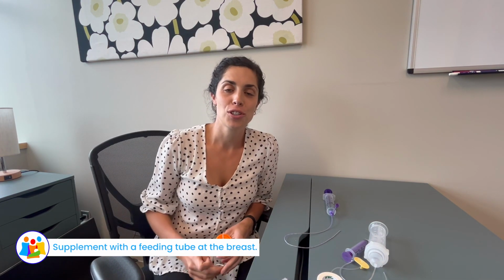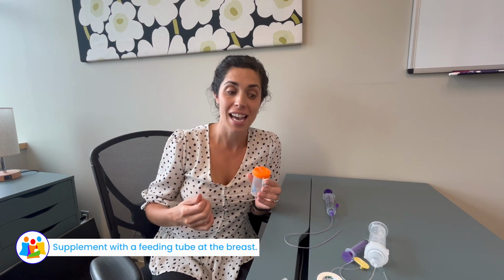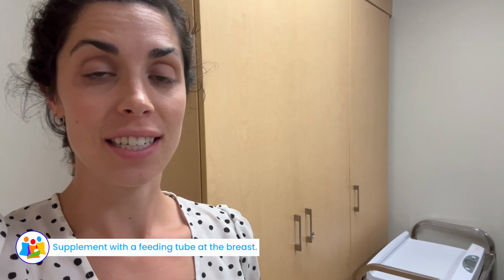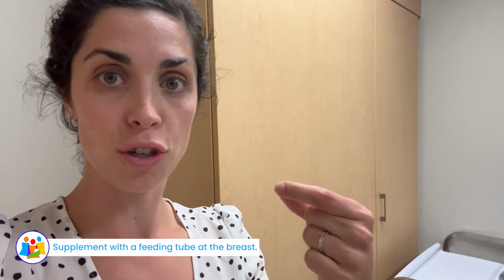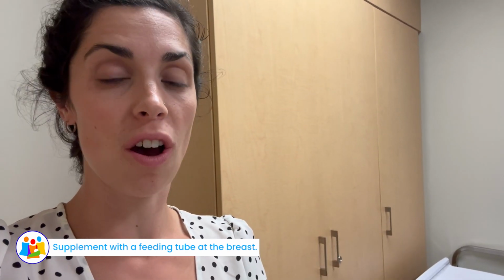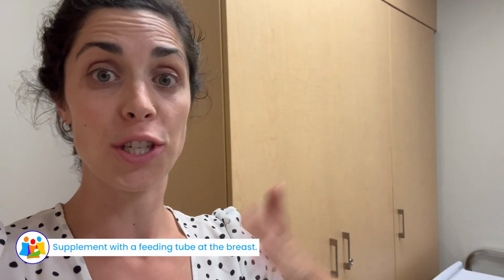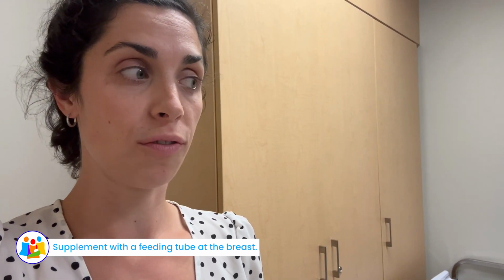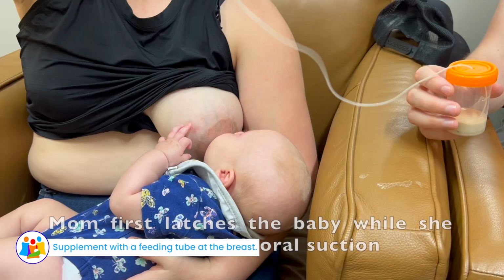I will now show a demonstration of a family using the supplementer system live with their 4-month-old baby. And what's cool about this dyad is they used another trick that I didn't mention, which was to slide the tube through the hole of a nipple shield, and that was how they initially got the baby associated with direct feeding, and have since graduated from the nipple shield to no shield, and are only supplementing for about 30 mLs of top up for a couple feeds of the day.